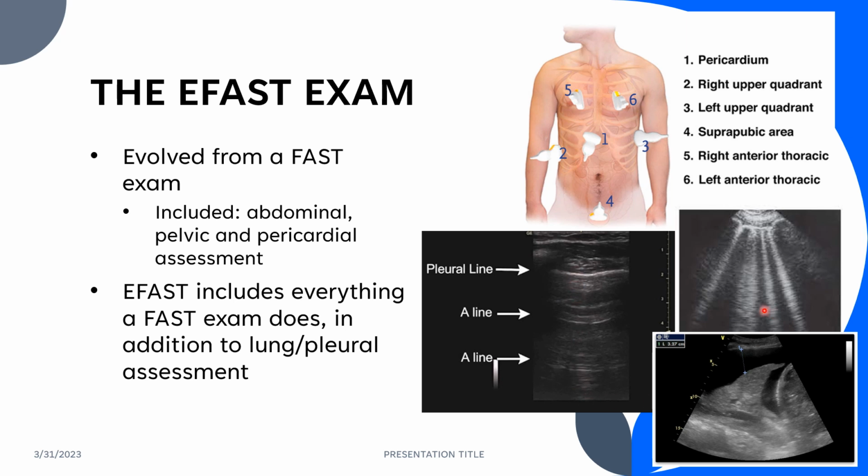Now, sometimes you can get something called B lines. B lines usually occur when the lung is inflated, but there's some sort of consolidation in the lung. So maybe they have some pulmonary edema or something like that, and because of that, they're having fluid in the lung. Fluid can transfer sound much better than air can. And so the lack of these A-line or ring down artifacts is going to demonstrate that there is really something in there that sound is able to transmit through and bring information back. While that's usually a really good property when we're using ultrasound, it's not a normal property of the lung. We call these B lines.